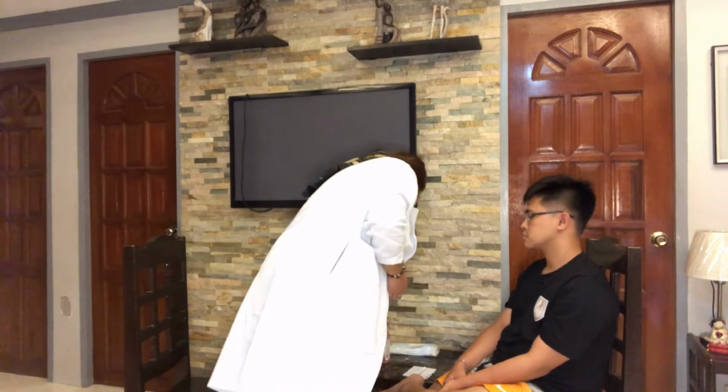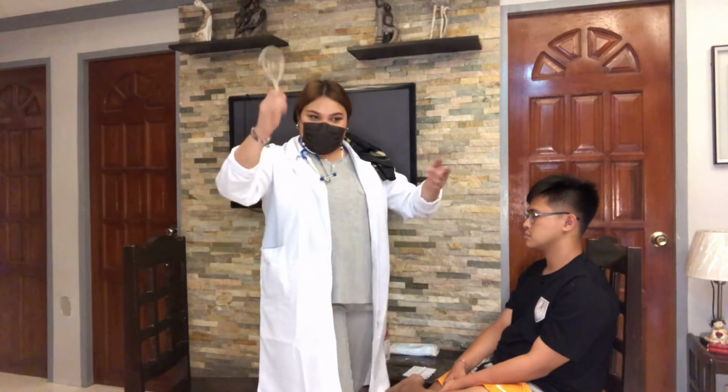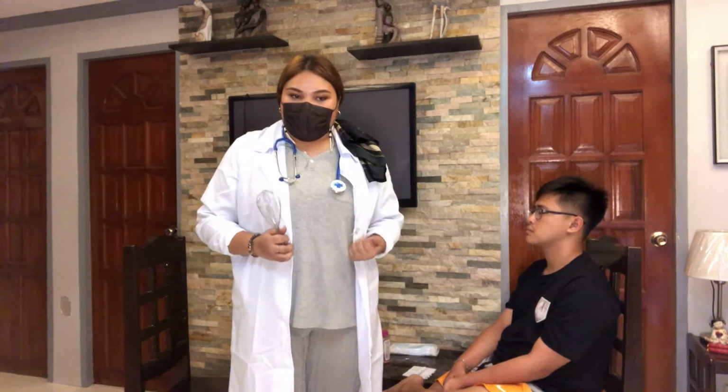Then we'll perform the Weber's test by holding a tuning fork. Let's just assume that this is a tuning fork. Activate it by tapping the fork gently against the back of the hand near the knuckles, or by stroking the fork between the thumb and index finger.